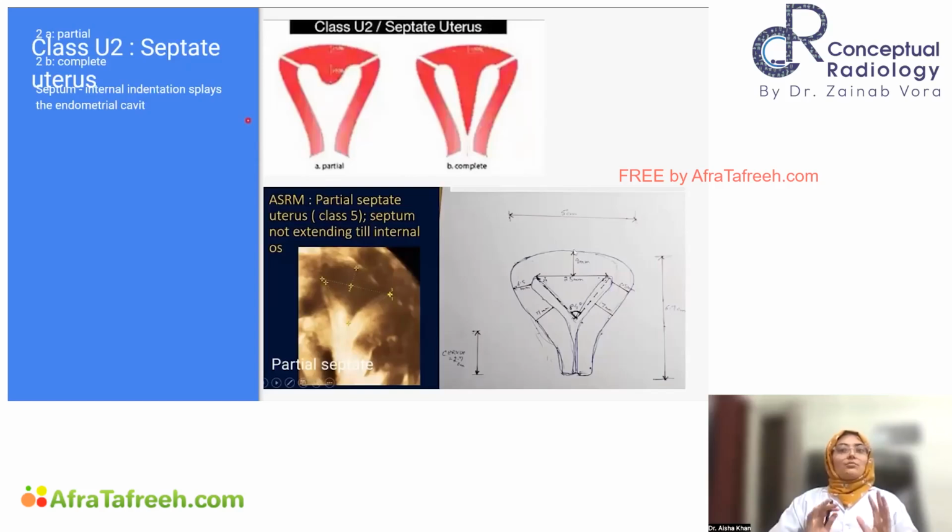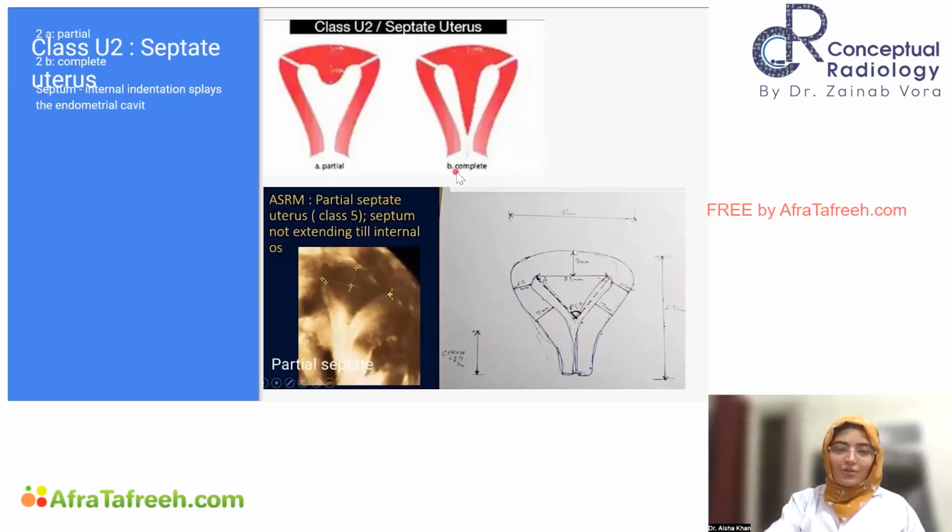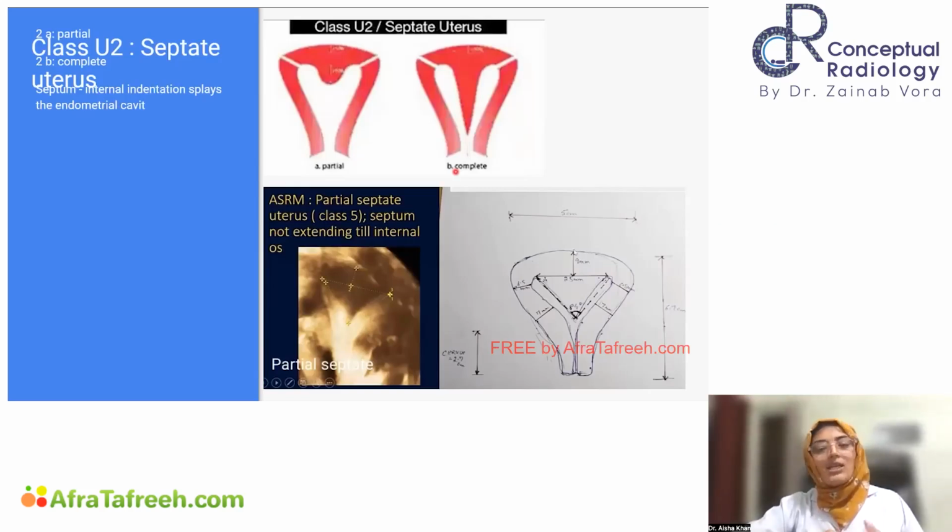Now we come to a little bit serious thing. That is your U2, that is septate uterus. Septate में two possibilities are there. 2A is partially septate and 2B is complete septate. And this we can see beautifully in these illustrations also. यहाँ पे हमें मोटिवेशन मिलता है. I've shared a handmade diagram with you. This is a really senior consultant and when he gives off reports, he ensures कि he has made a handmade diagram that increases the credibility of our reports.